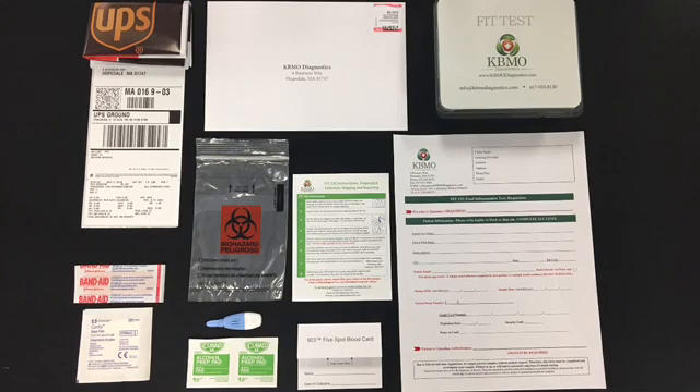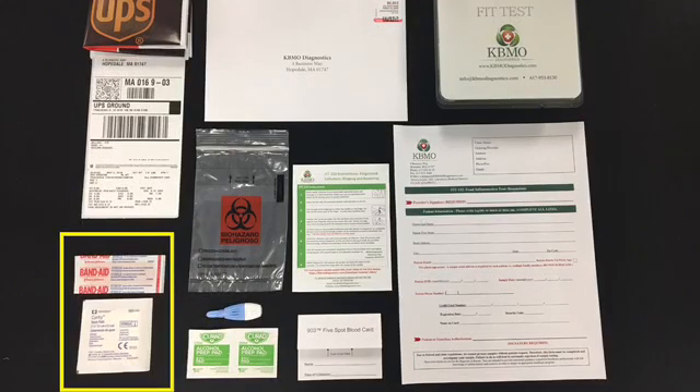In addition to these items, you will need a Band-Aid and a piece of gauze.